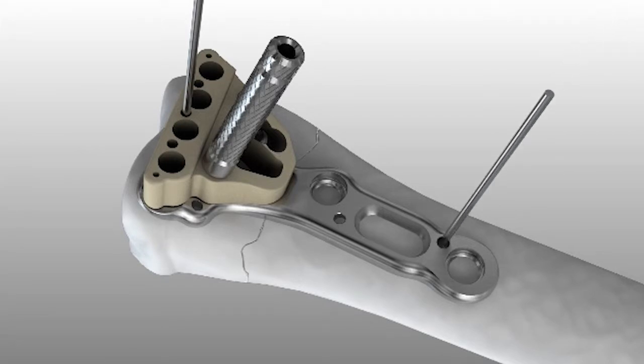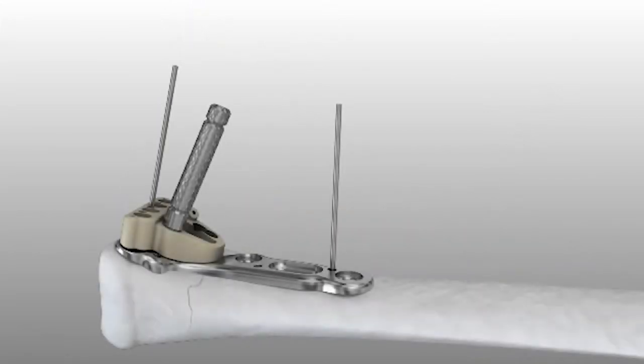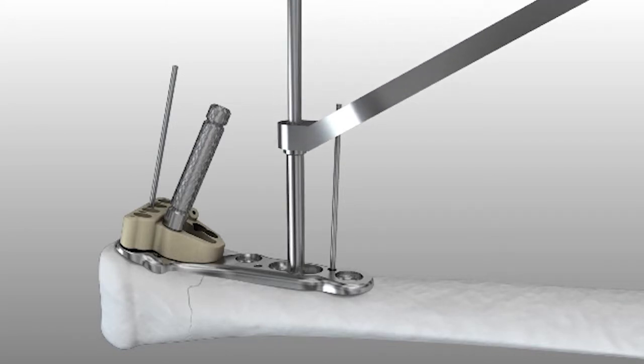Once the desired position is achieved, secure the plate with .054 K-wires or plate tacks. Plate tacks can be used in proximal K-wire or screw holes only. The first screw to be placed is a 3.5 mm non-locking cortical screw through the slot in the plate.